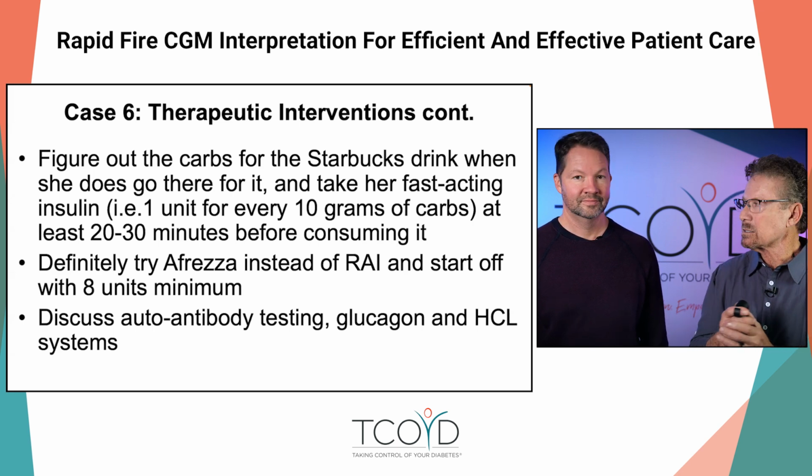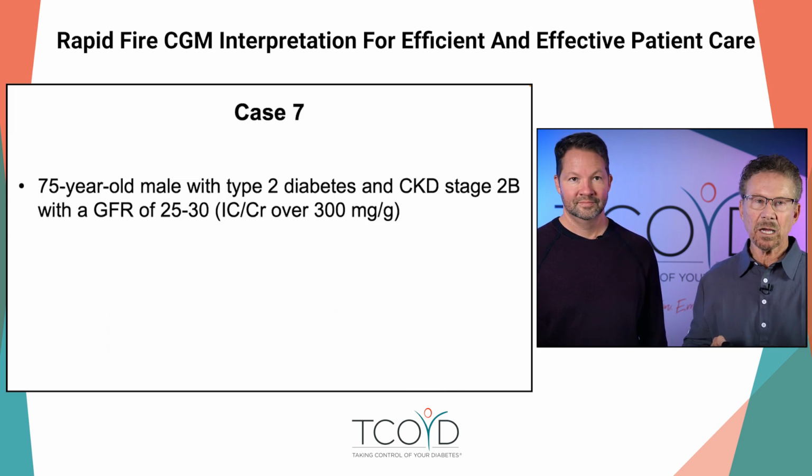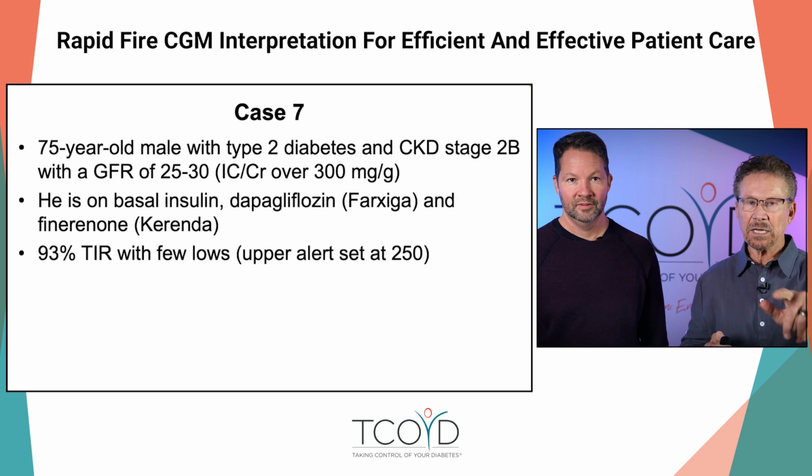And I put this on every case now because people have to start remembering that we need to start screening people. Okay. This is the last one? Yeah. So you get some information first.